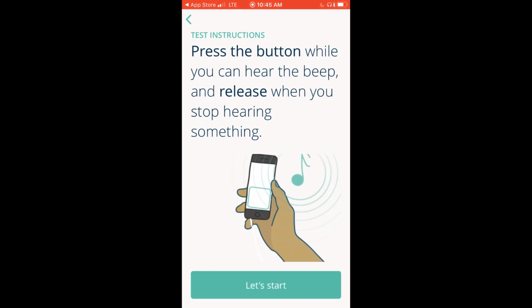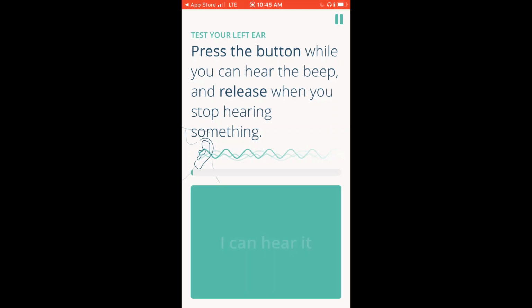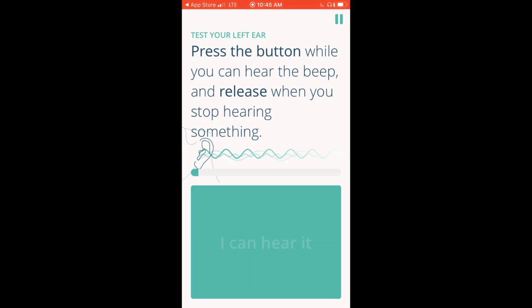So now here are the instructions. You're going to press a button when you hear a sound, and you're going to let go of that green box on the screen when you can no longer hear it. So when you hear a sound, you press, the whole box turns green. So I can hear, and then it went away. And so I took my thumb off the button, and I'm going to keep doing that.